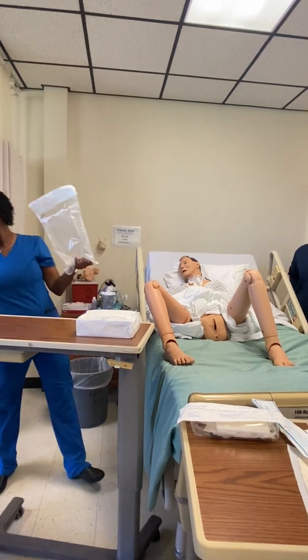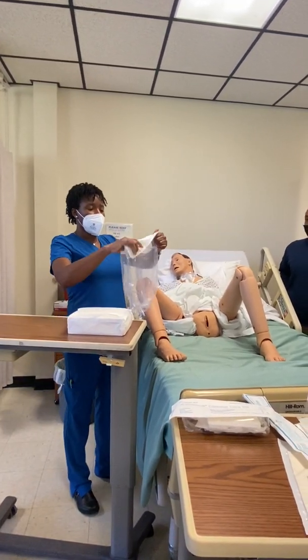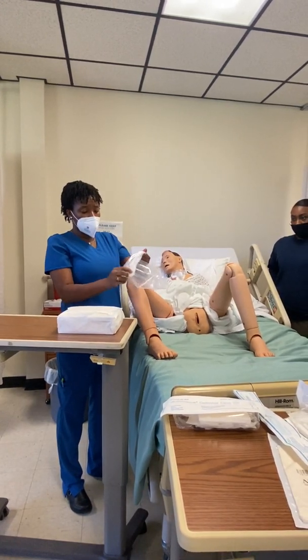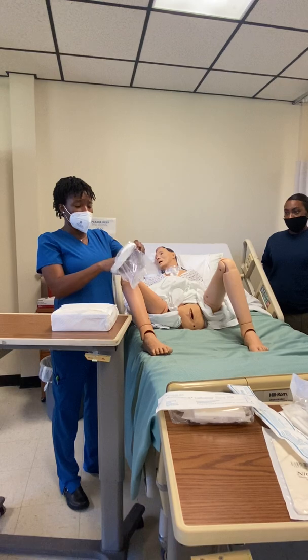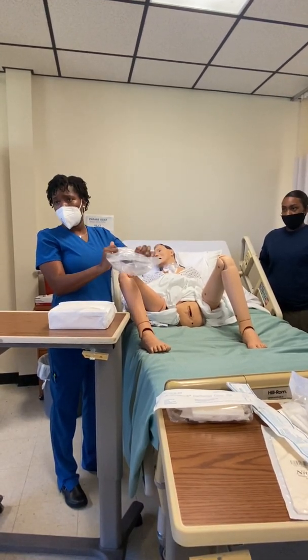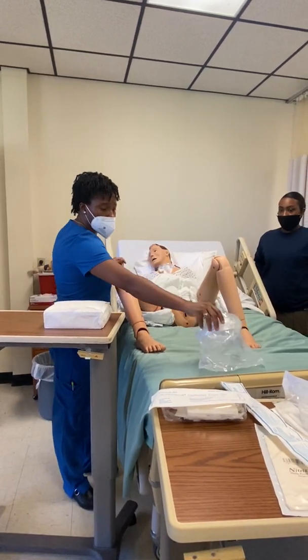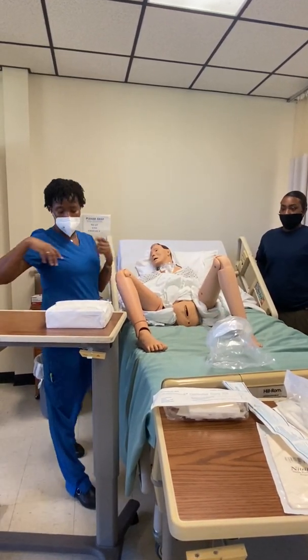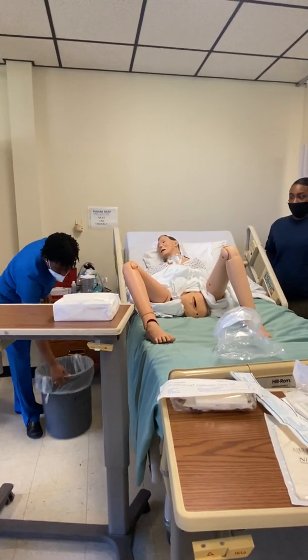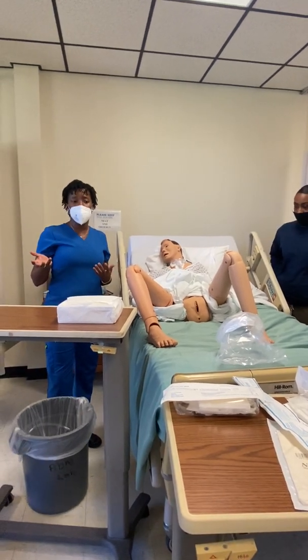Okay? All right. Some people choose to use this plastic to throw away their things. It's completely up to you, or you can use the garbage can. I'm one of those that like using the garbage can because I don't want to risk trying to go over my sterile field. But that's completely up to you. If you choose to use the bag, you can use the bag. Okay? The garbage can. Oh, it's here. So you can make sure your garbage can is there. However you want to do it, that's up to you.